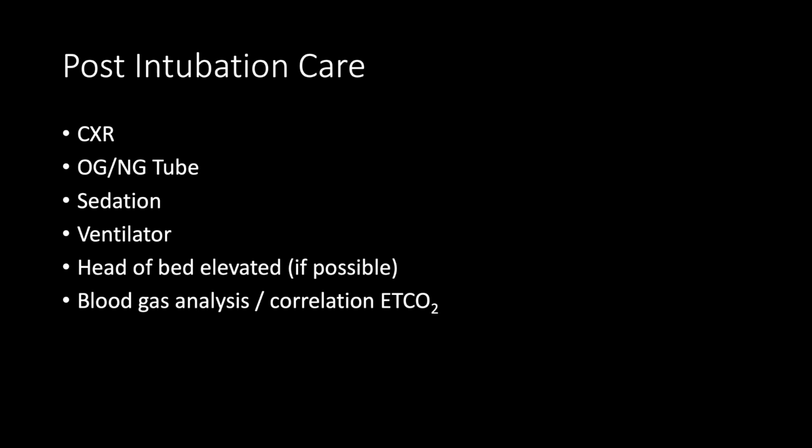This patient, although they received a dose of a sedative during the actual RSI attempt, it's now time to start this patient on a sedative infusion with an appropriate drug and an appropriate dose to keep them comfortable and control their physiology. Ultimately, we advocate that all of these patients get transitioned from a BVM to a ventilator so that we can deliver regular, safe breaths at appropriate pressures for the patient in front of us and decrease lung trauma.